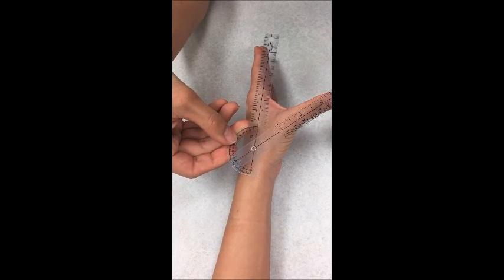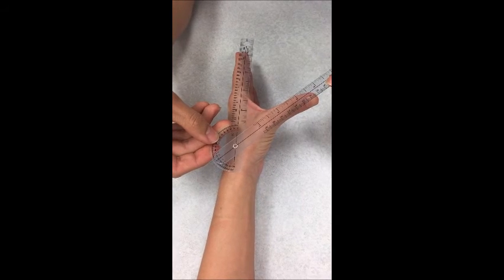Normal range of motion for palmar abduction alternative method is 0 to 50 degrees.